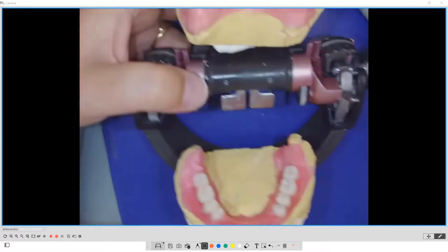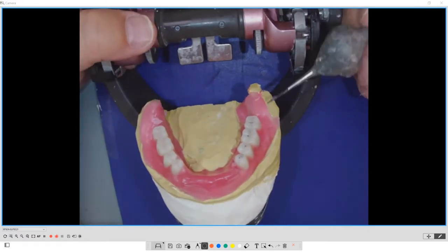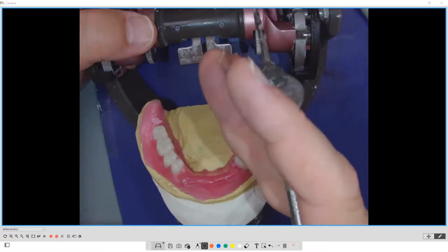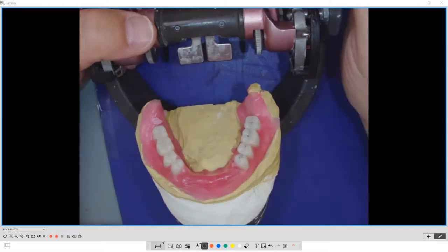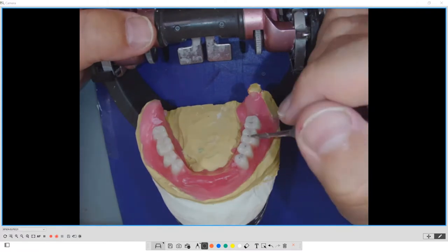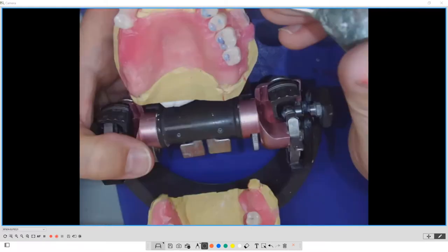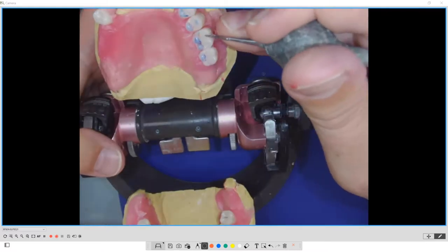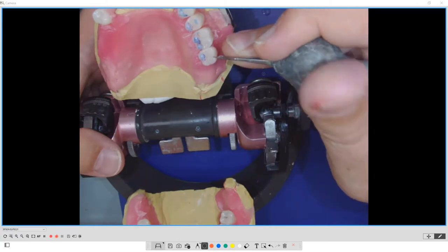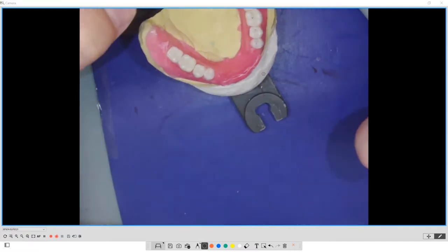I start out with the digital. The software is going to set the teeth into position, but I know coming out of production, when I touch them into centric, I'm going to have that little bit of wiggle room. And if I have to, I can manually adjust the teeth, because even Vigo is still made from acrylic glass. I still have that. Or in the software, if I know that I have a little bit more of a horizontal chew cycle, I can manually go in and manipulate these cusps and tip them a little bit manually as well. So I can do that digitally, pardon me. I can tip them digitally from where the software set them up.